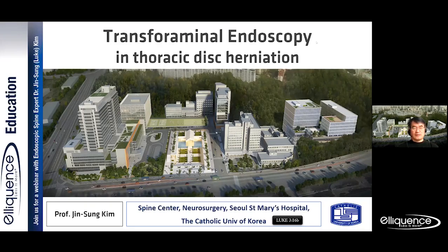I'm not sure you are on the same page with me about transforaminal endoscopic discectomy for the treatment of thoracic disc herniation. Just to bring you guys up to speed, let's move on to today's topic. It's about the transforaminal endoscope in thoracic disc herniation.